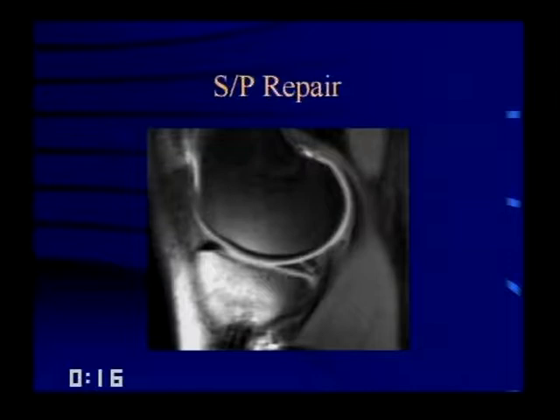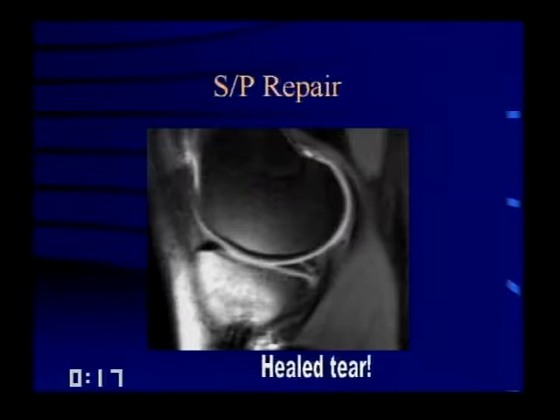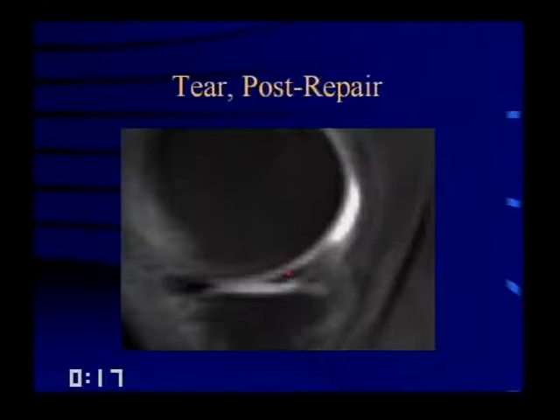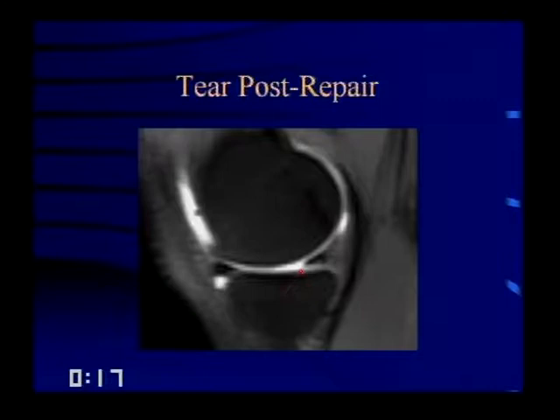Here's a case we thought was a recurrent meniscal tear — it looks bright, possibly gadolinium going in — but it was just a healed tear. Here's another: a tear pre-repair and post-repair shows a little signal going up and then a pixelated image showing gadolinium barely entering the posterior horn. Additionally, truncation of the triangle of the posterior horn represented not only a tear that hadn't healed but a new radial tear as well.